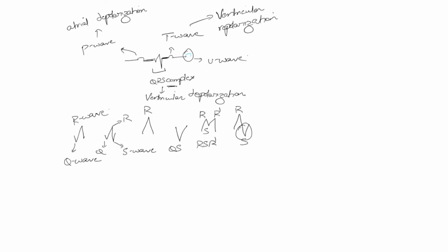All right, very good. Now, let's also go ahead and look at a few other things. In an EKG, when you're referring to a segment, it's a straight line. And when you're referring to an interval, it usually includes at least one wave. So when we refer to, let's go ahead and draw this back.